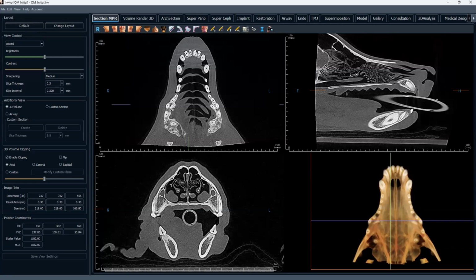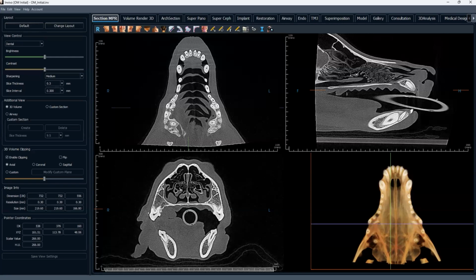But because we don't know much about this tumor and because it's associated with the teeth, I always worry about whether or not it might invade the periodontal ligament space and things like that. And so if I'm going to take the teeth, I try to take the entire alveolus. And so, it can be a little bit tricky to take the entire alveolus of the caudal teeth, the premolars and molars, but spare the infraorbital and the nasolacrimal duct, right? So we've got that here and there.